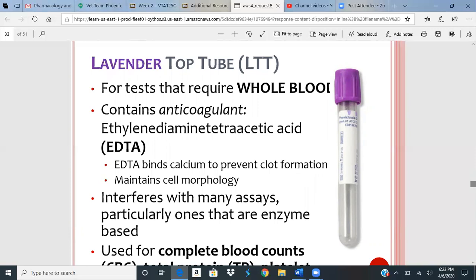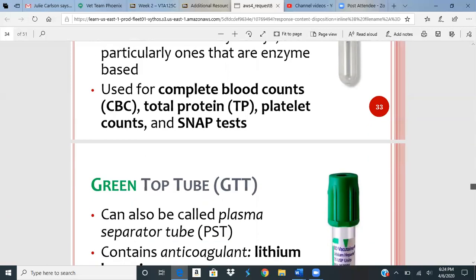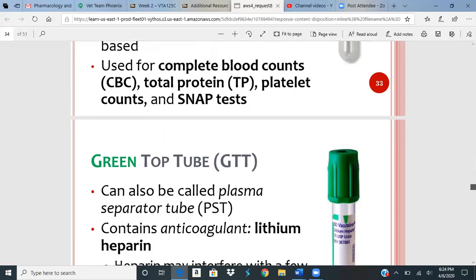What we do is as soon as we get the blood in that tube, we take it and we'll kind of mix it. We don't shake it up. We just move it back and forth in the tube to make sure that all the blood is touching all of that EDTA. So CBC, complete blood count, total protein, platelet counts, and then SNAP test I mentioned, 4DX, that's a SNAP test. The reason it's called a SNAP test is just the way that it snaps down. We have to actually push it down to close it and snap it in place.